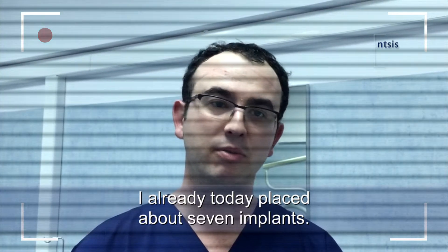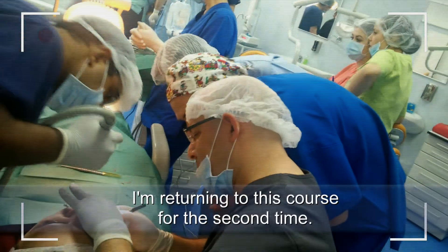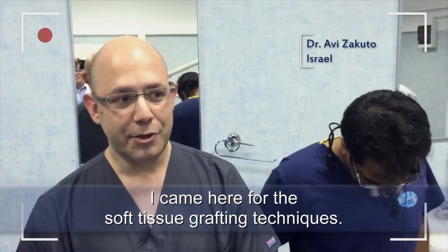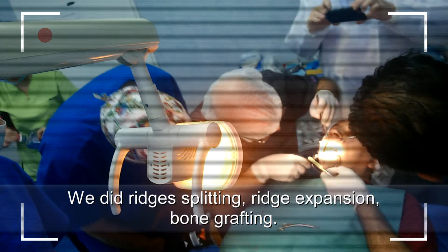I already for today placed seven implants. I'm attending this course for the second time. I came here for the soft tissue grafting techniques. We did ridge splitting, ridge expansion, grafting.